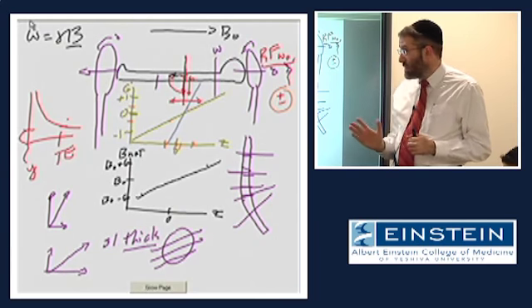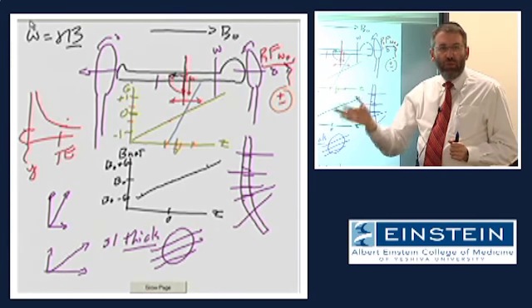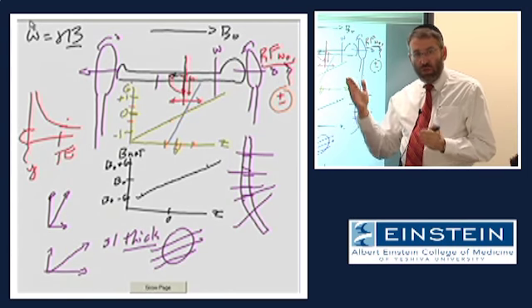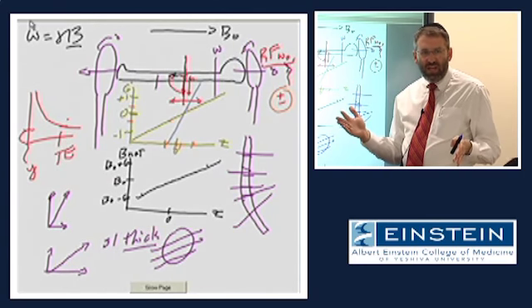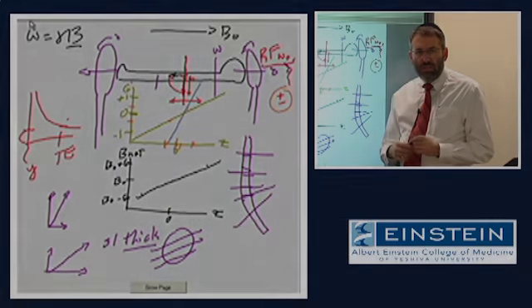The slice position, of course, as we said, does not have to remain at isocenter. That can be adjusted simply based on the frequency that we transmit. And of course, if you were to generate an asymmetric gradient magnetic field, you would need to account for that in how you tune your RF to select the correct slices.